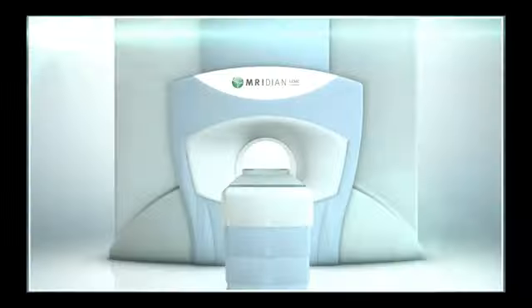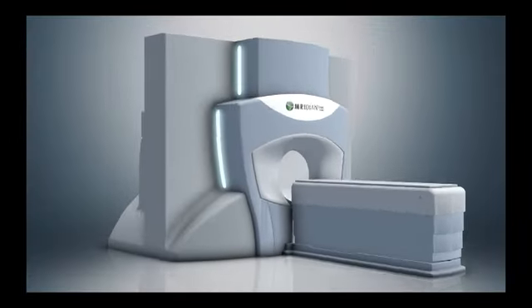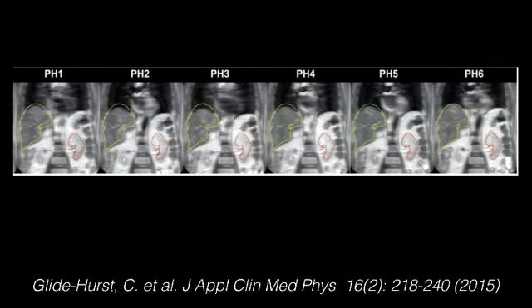I'd like to wrap up this video by talking about MR-guided radiotherapy. This is enabled by new technology in which the linear accelerator is combined with an MR scanner. Here's one of the systems. There are 2 vendor systems out right now. Inside is an MR and a linac. The MR allows you to visualize soft tissue.